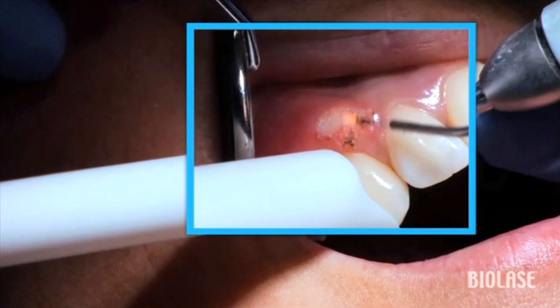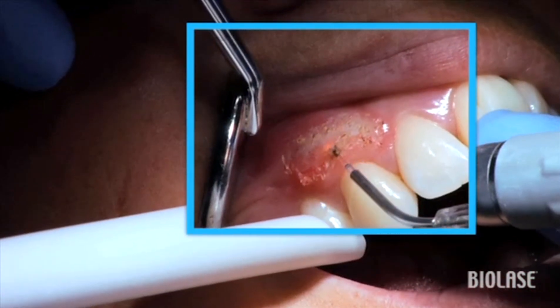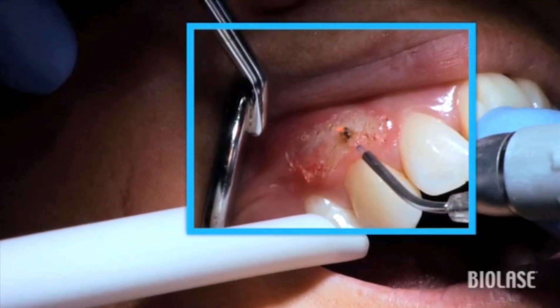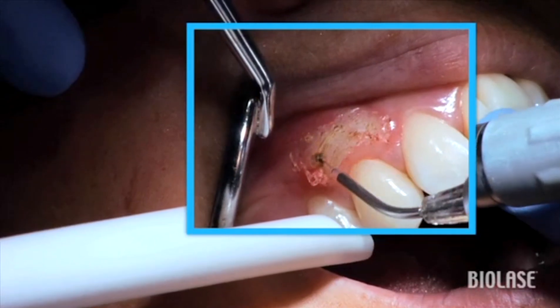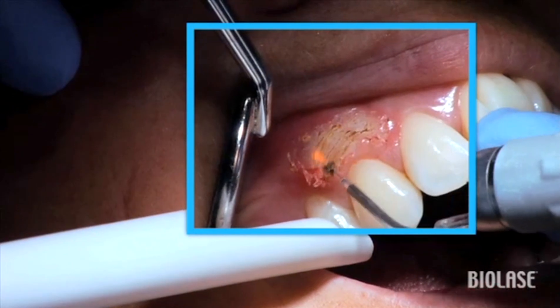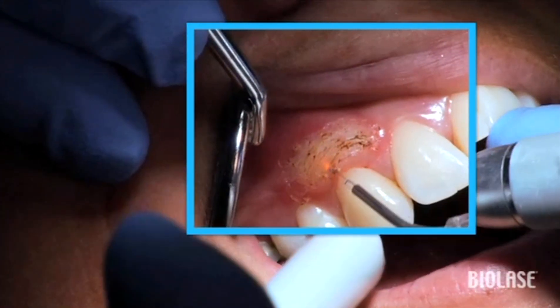In a patient with excessive gum tissue covering the teeth, you would expose the teeth holding the tip perpendicular to the tissue and then thin the thick tissue holding the tip parallel to the tissue. In cases like this that only require thinning the tissue, hold the 400 micron tip parallel to the tissue and decrease the gingivectomy preset by 0.3 watts from an initial setting of 1 watt.